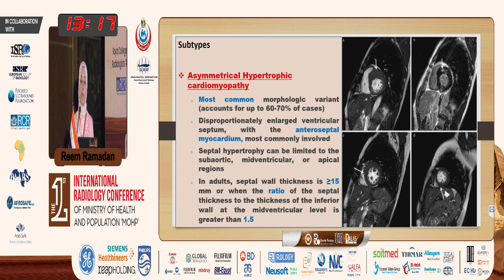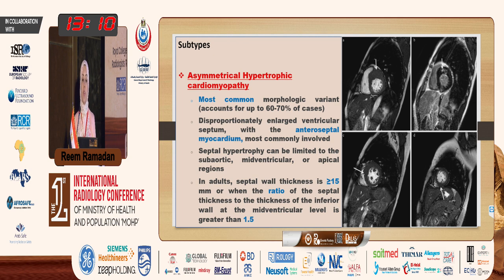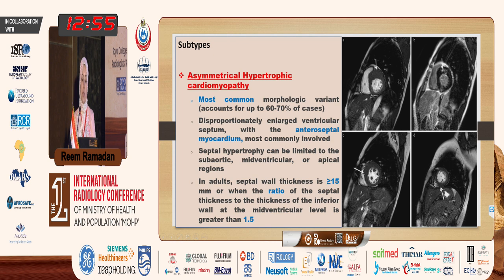As for the morphological subtypes of HCM, the most common type is asymmetric HCM, accounting for 70 percent of cases. There is disproportionate enlargement in the ventricular septum — most commonly the anteroseptal segment is involved. As we see here, this is the anteroseptal segment in blood pool images, short axis. Image A is pre-contrast; image B is post-contrast after gadolinium enhancement, showing patchy foci of fibrosis at the hypertrophied segments.